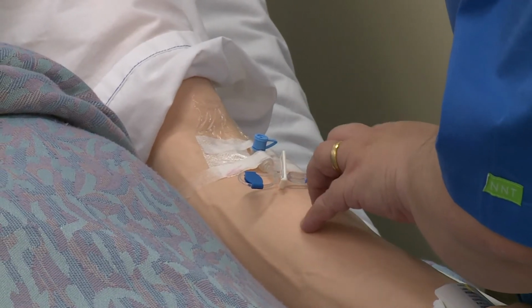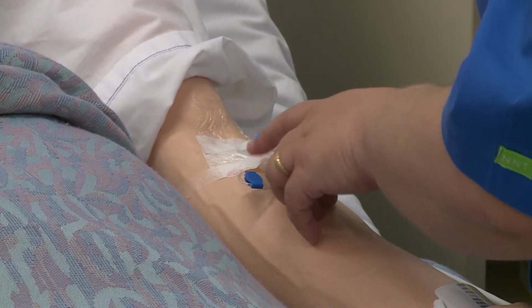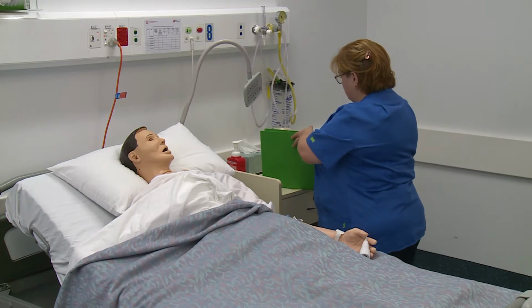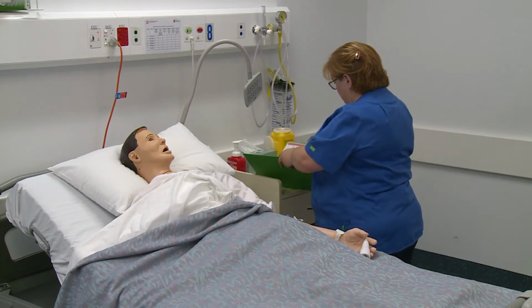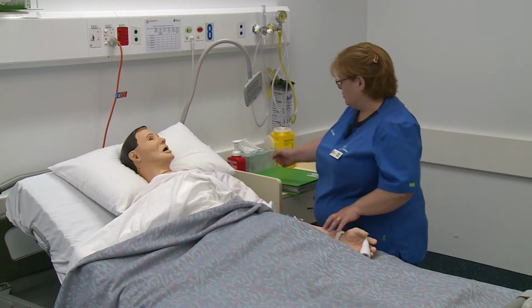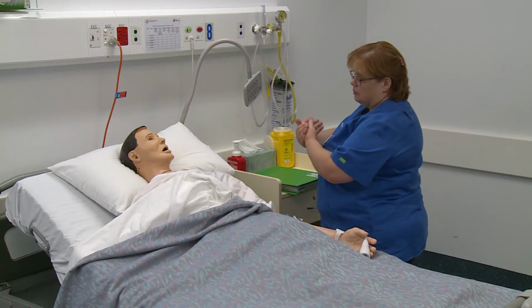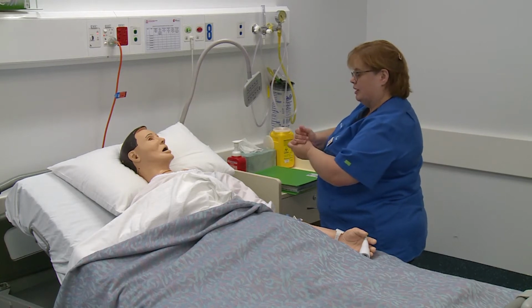So it's not looking red, no inflammation, no signs of swelling, and looking at your chart, it has just been put in yesterday. Okay, so we're within our 72 hours for use of your cannula. So I'm just going to go ahead and prepare your IV medication. All right.